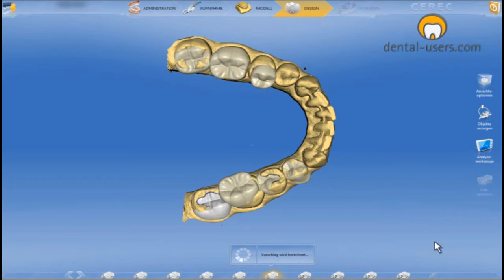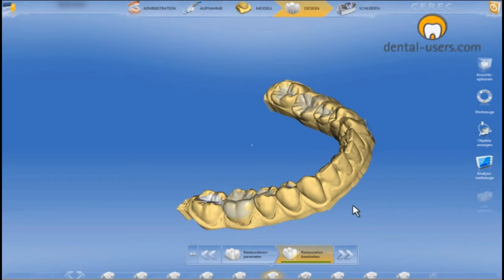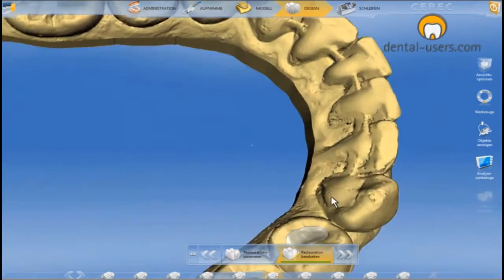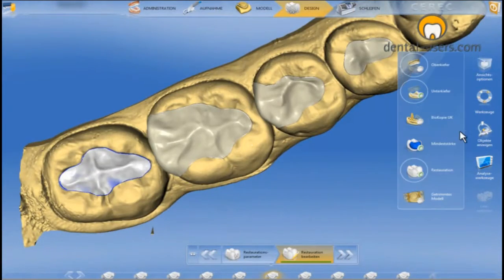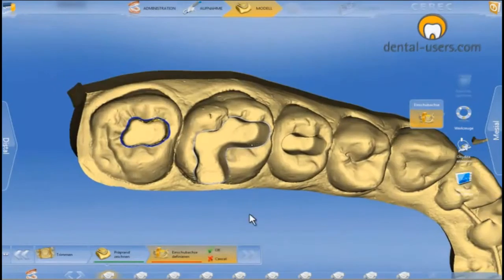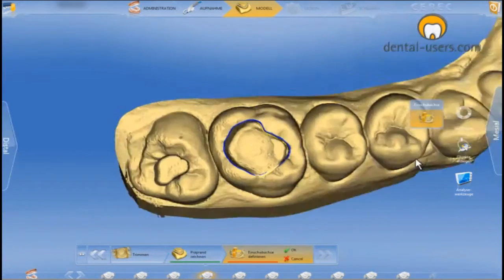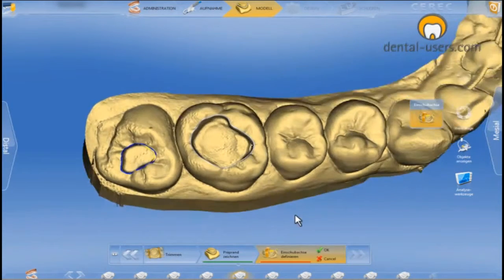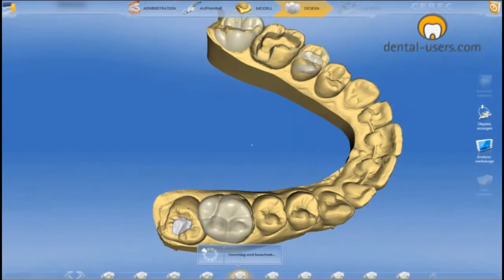We scanned this into CEREC 4.0 and constructed it. Here we can see the biogeneric suggestion, which was right first time. The same applies to the upper jaw. We drew in the preparation margins, determined the axis of insertion, and calculated the biogeneric suggestion.